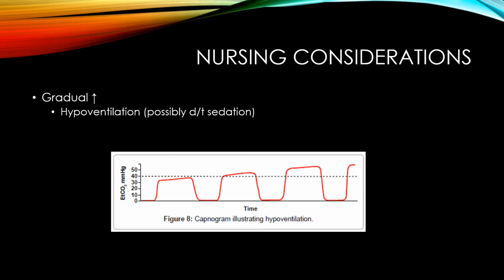Okay, a gradual increase in end tidal CO2, consider hypoventilation. This could be related to sedation. If the client is rebreathing previously exhaled CO2, the end tidal CO2 values increase and the baseline may elevate. The waveform may not return to 0 at the end of each inspiration.